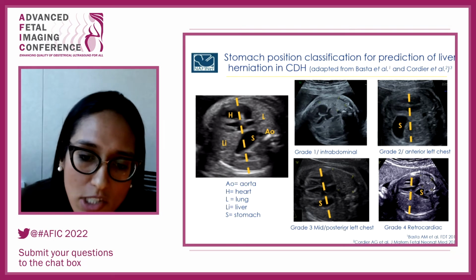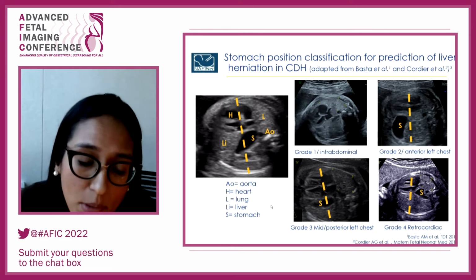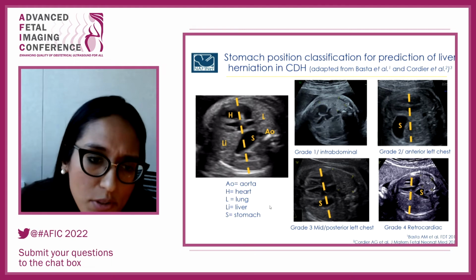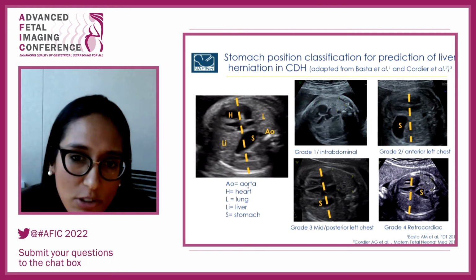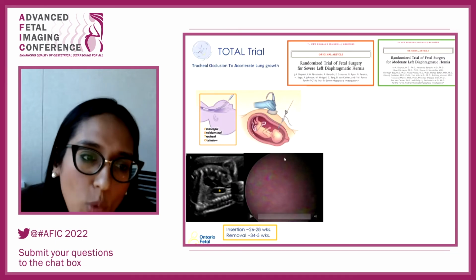And stomach position has been correlated with neonatal or perinatal morbidity and mortality as well. So it's also an important tool, and I would say a little bit easier, to assess liver herniation. So again, why does this all matter?